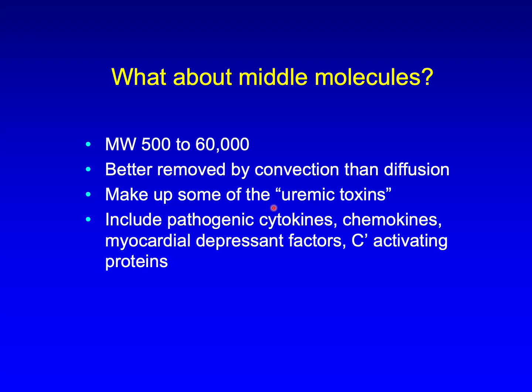Other potentially pathogenic middle molecules that have been shown to be cleared with the convective therapies include various cytokines, chemokines, myocardial depressant factors, complement activating factors, and things that could play a role in patients with sepsis and heart failure.